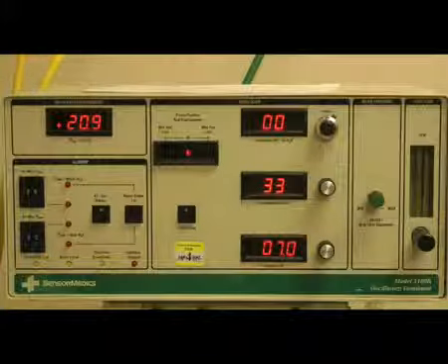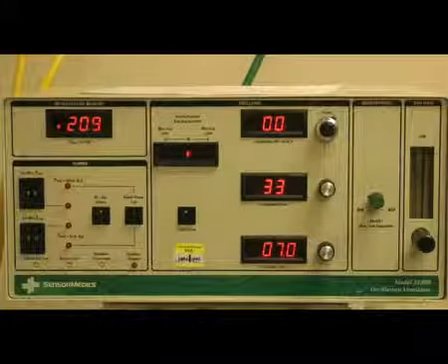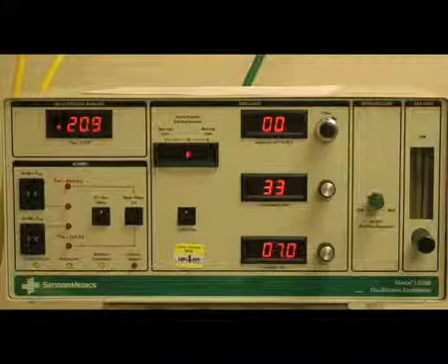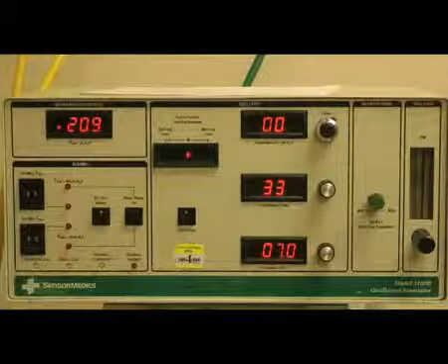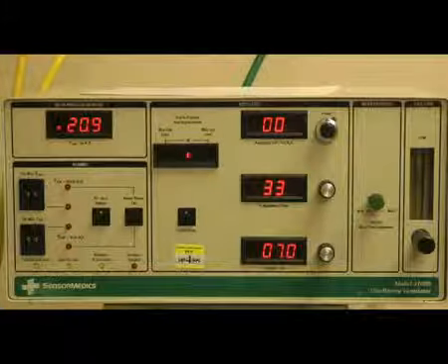Once you have made these adjustments, you'll want to perform an initial recruitment maneuver. This will help maximize the lung expansion and recruitment of atelectatic alveoli in a patient with ARDS.